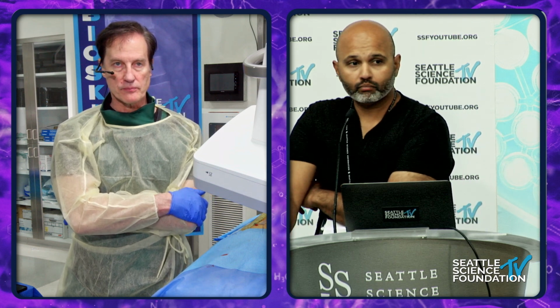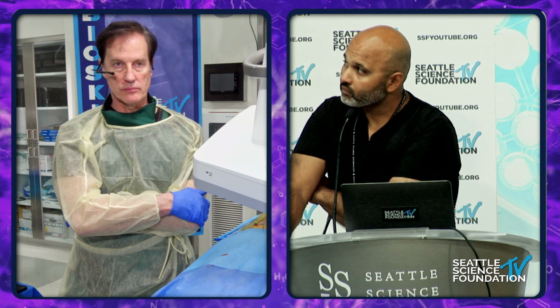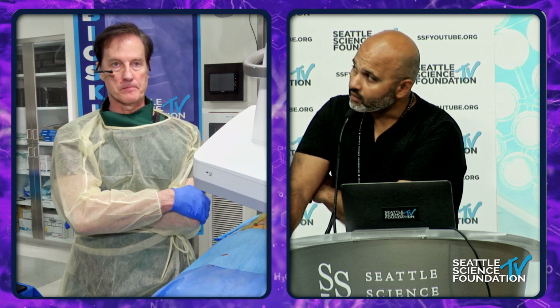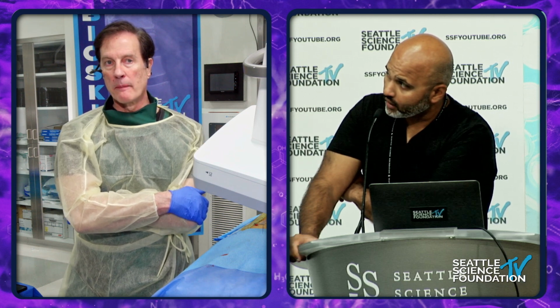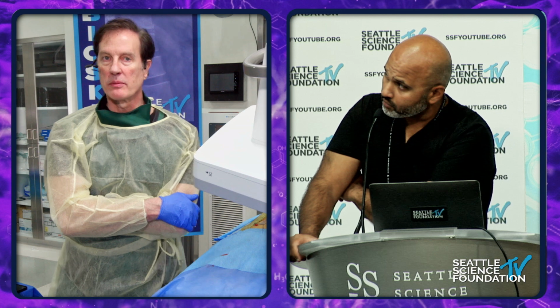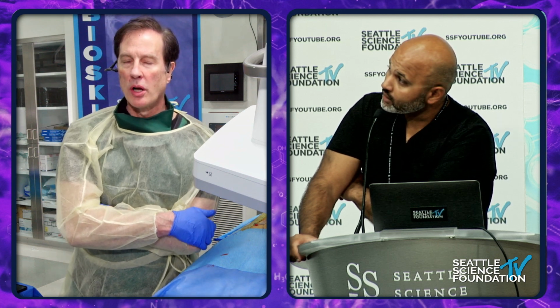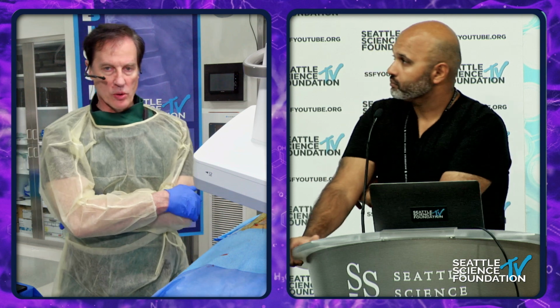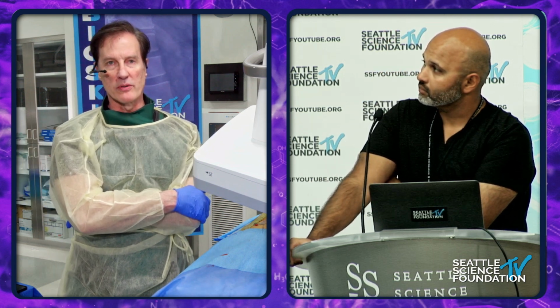Have you ever used the SI-BONE iFuse-X or heard of that? Any thoughts on it? Say again. The SI-BONE iFuse-X. Oh, iFuse-X, yeah. So you have iFuse and then iFuse-X. iFuse-X is the smaller device.